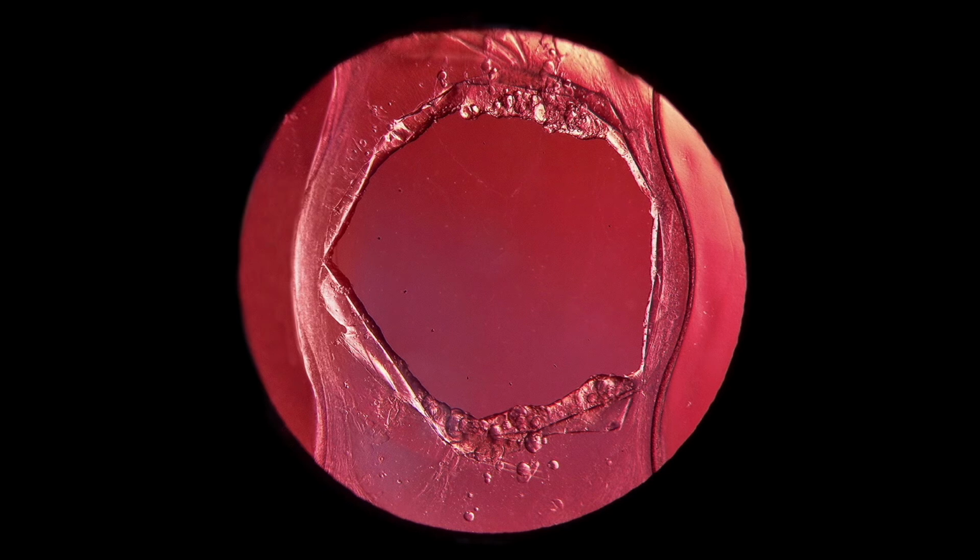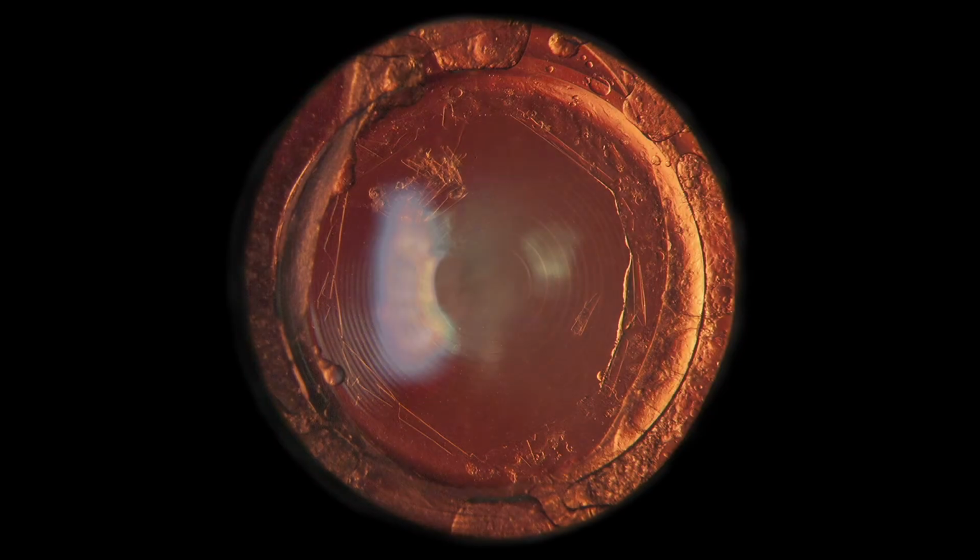An alternative approach is the circular or can opener technique, where a round opening in the posterior capsule is created. If pits are created, they usually are not a disturbance because they are away from the optical center and visual axis. The freed capsule lobe is left to float in the vitreous body.